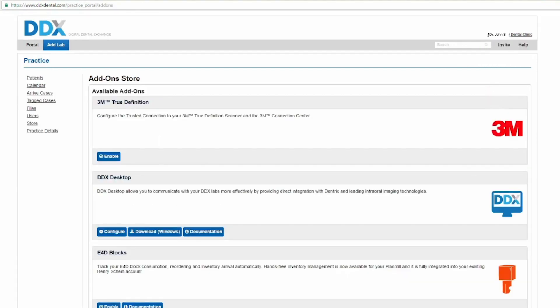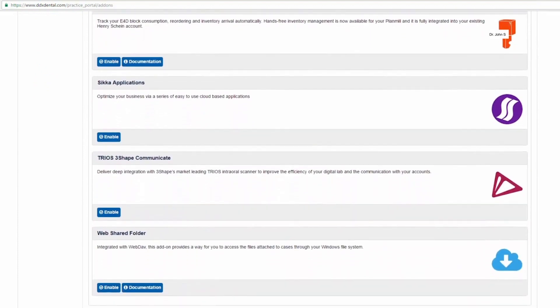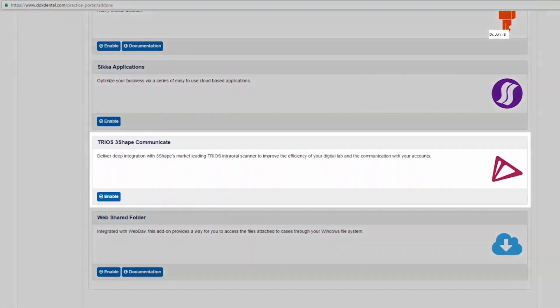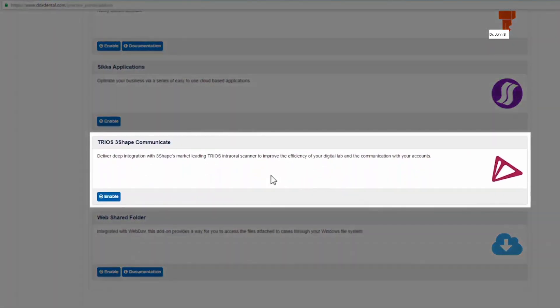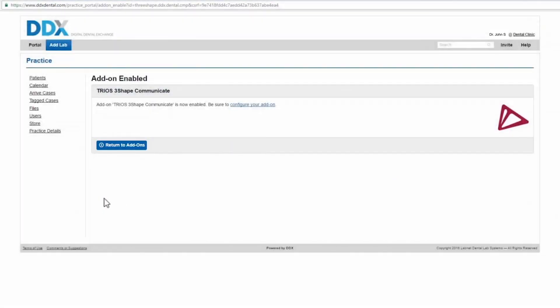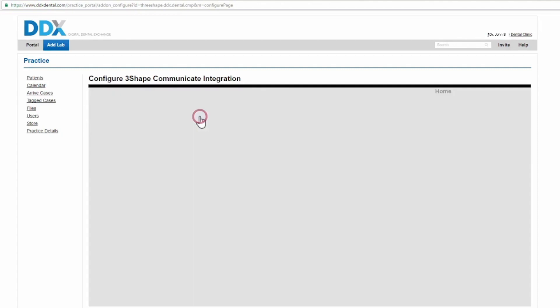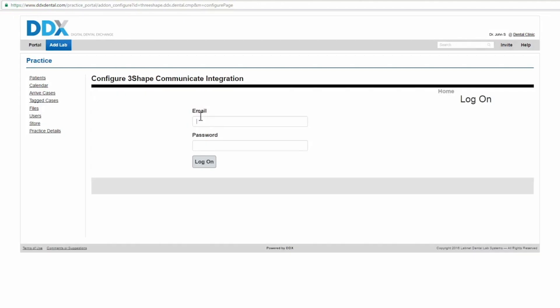Scroll down to find TRIO's 3Shape Communicate and click Enable. Click on Configure your add-on. Click on Authorize with 3Shape. Enter your 3Shape account and click Log on.